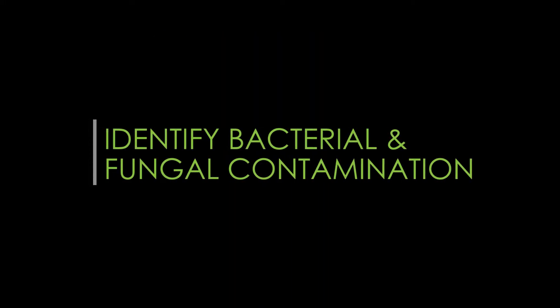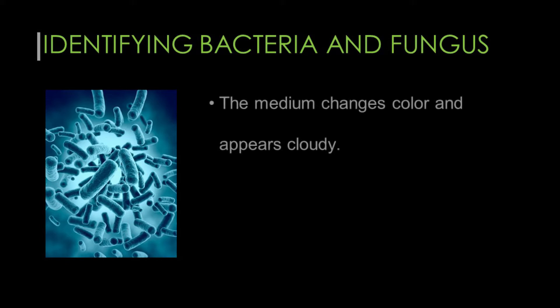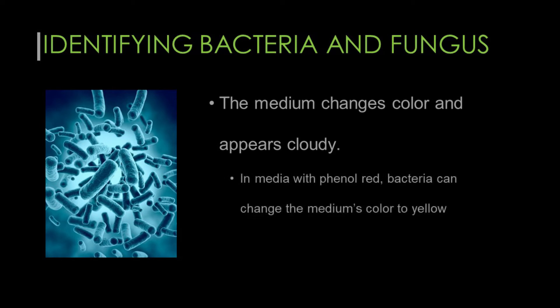How do you identify bacterial and fungal contamination in cell culture? Bacteria and fungi are common contaminants in animal cell culture. Usually their presence can be detected by observing the following changes. The medium changes color and appears cloudy. In media containing phenol red, bacteria can change the medium's color to yellow, but fungi will change the medium's color to pink.